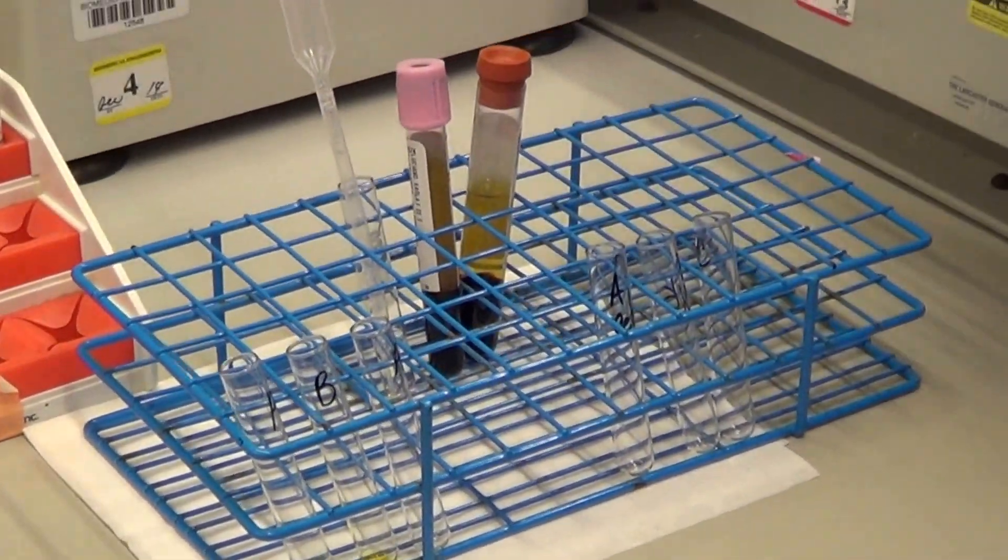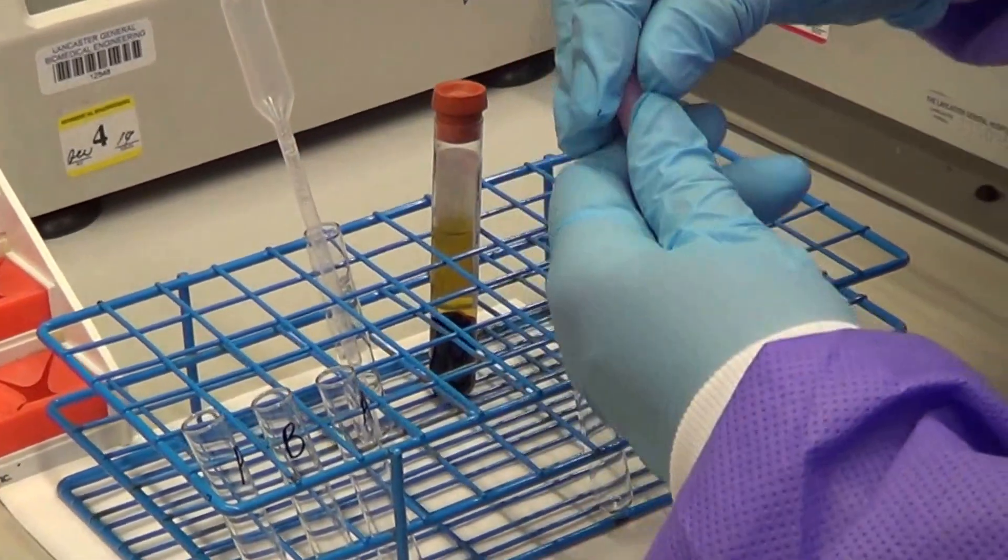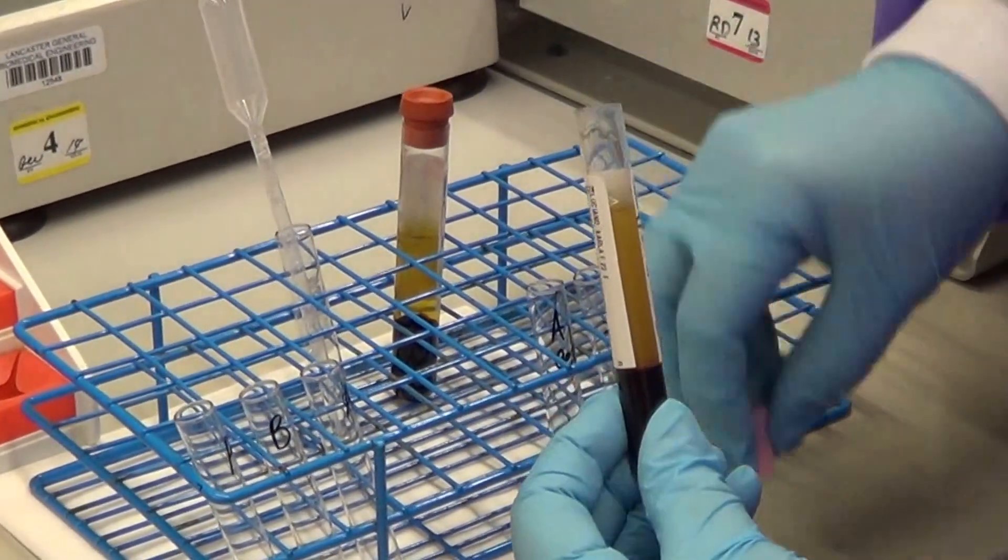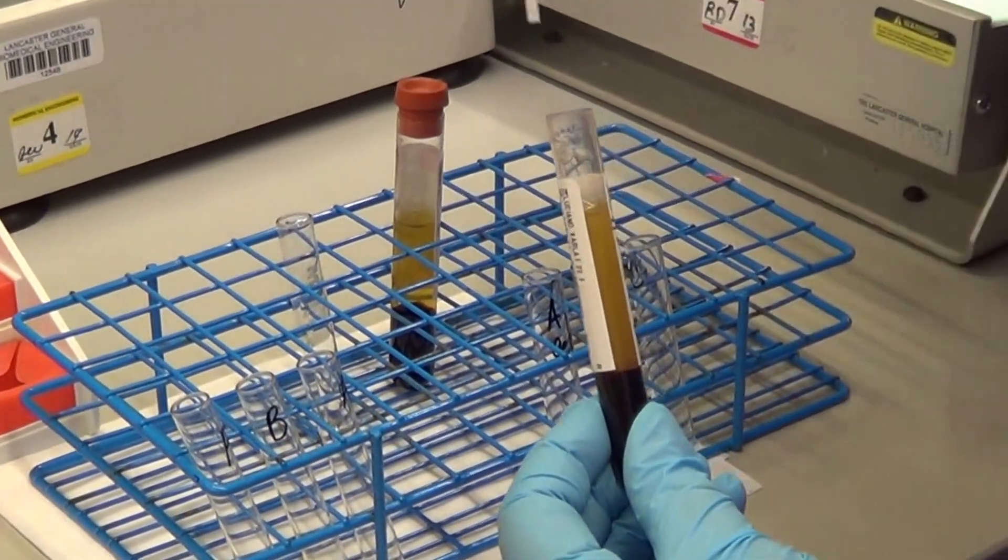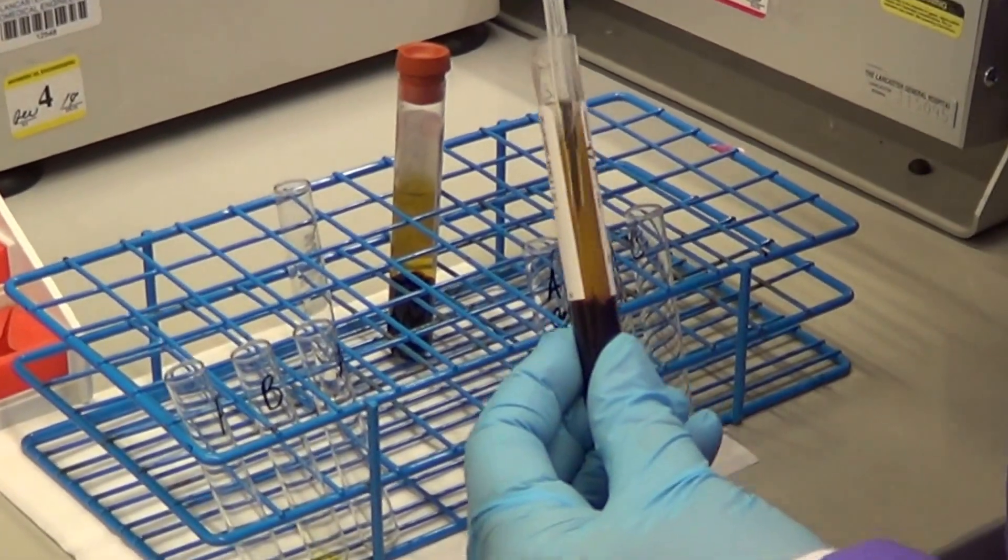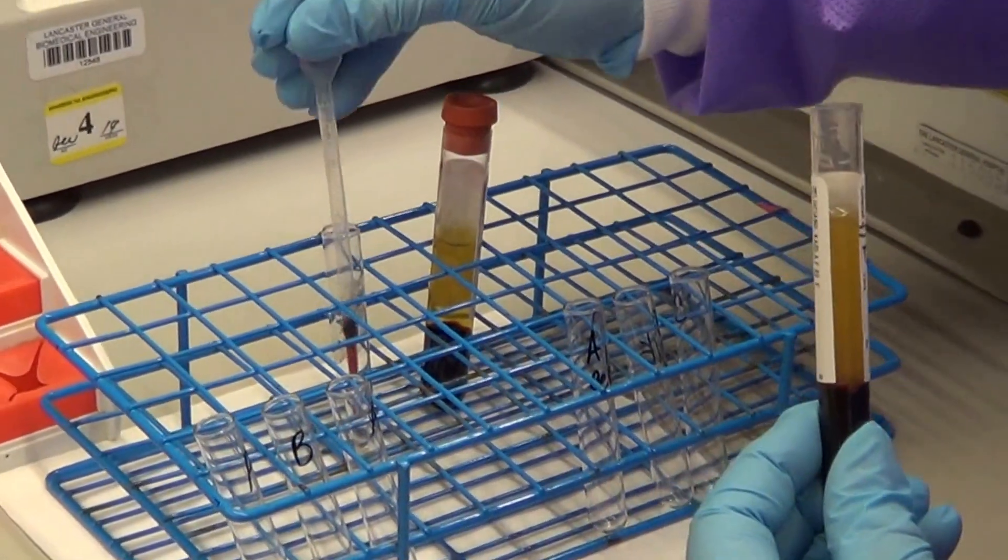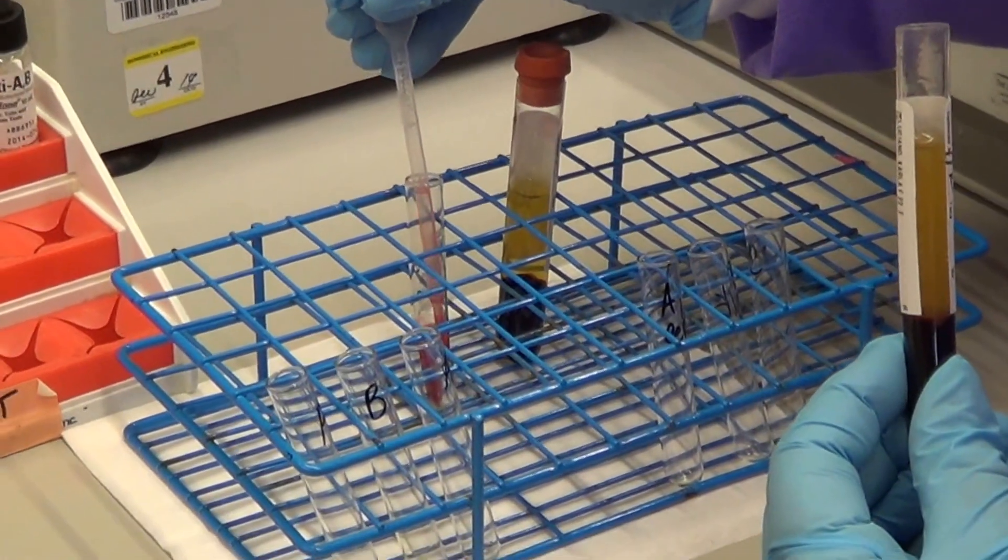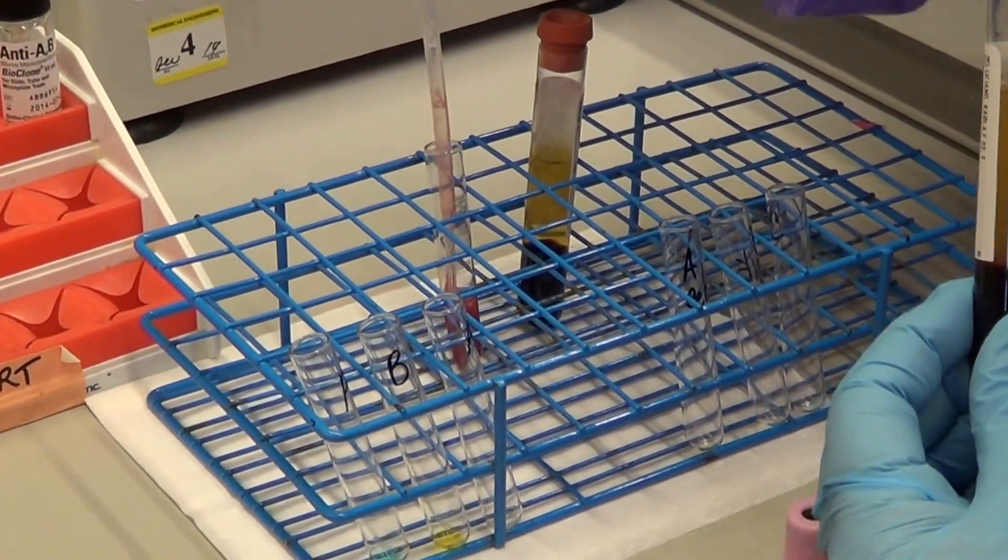The next step is to make your cell suspension from your patient sample. Take your EDTA sample, use a pipette to get red cells, and mix it in 0.9% saline to a 3-5% cell suspension.